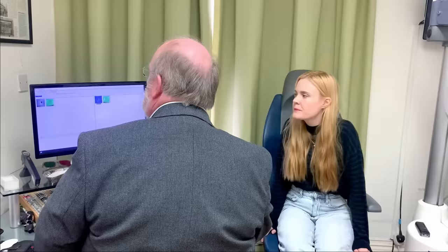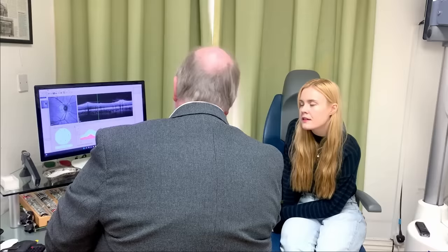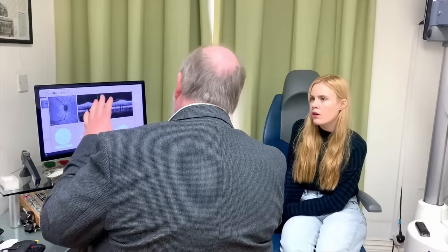So we did some three-dimensional scanning of your retina. So this is the optic nerve. The optic nerve is what takes all the information off to the brain and turns it into an image for us. It's also known as the blind spot. Because it's just neural tissue, there's no photoreceptors there at all. So thankfully we don't see this big area of nothing in our vision because our brain fills it in nicely for us.